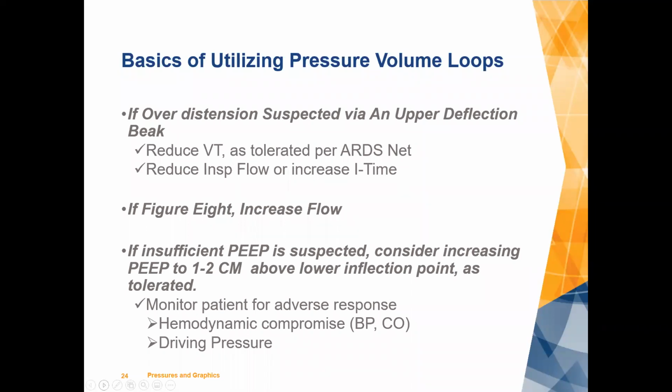So PEEP, generally, is incremental. Tidal volume is often, if you will, decremental, where you're coming down in order to achieve the delicate balance of adequate ventilation and oxygenation, but at the same time, coming down on that in order to manage your pressures, your plateau pressures and your driving pressures.